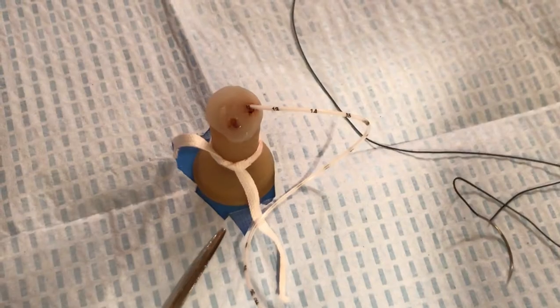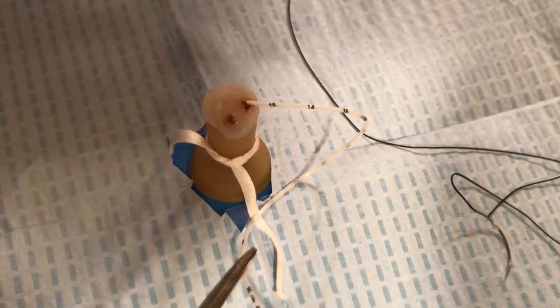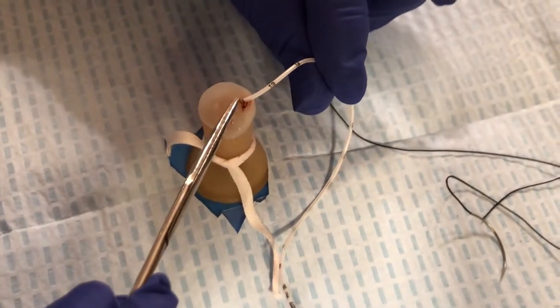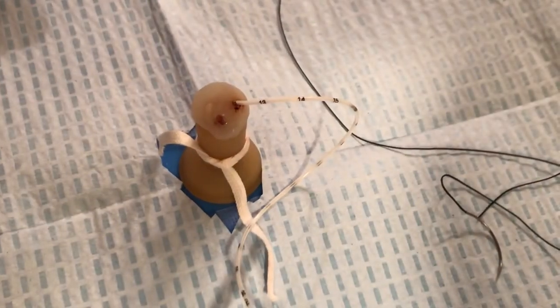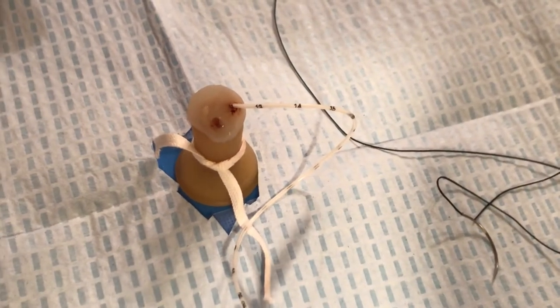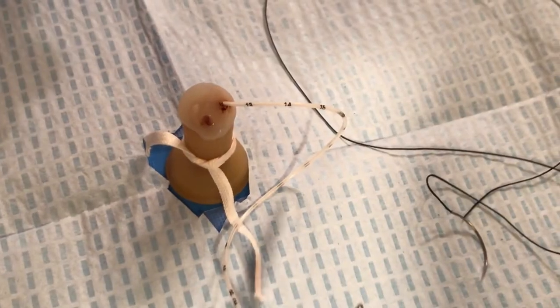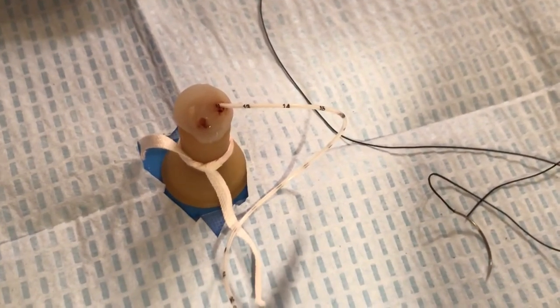For the purpose of this suturing video, we will suture the umbilical line at the 12-centimeter marking, which is right here at the opening to the umbilical vein. We will be leaving the needle on the suture until the end of the procedure, so be careful that you're aware there is a sharp on your sterile field throughout the suturing process.